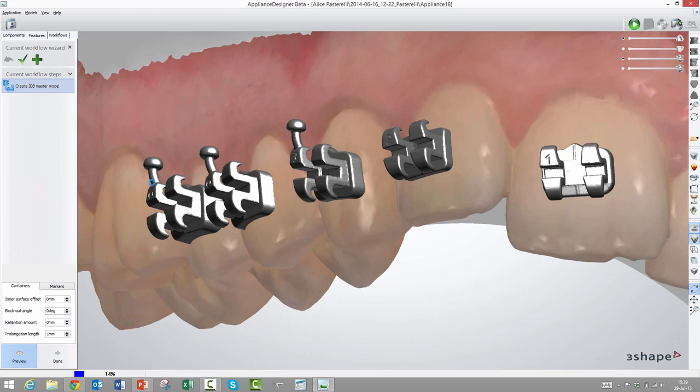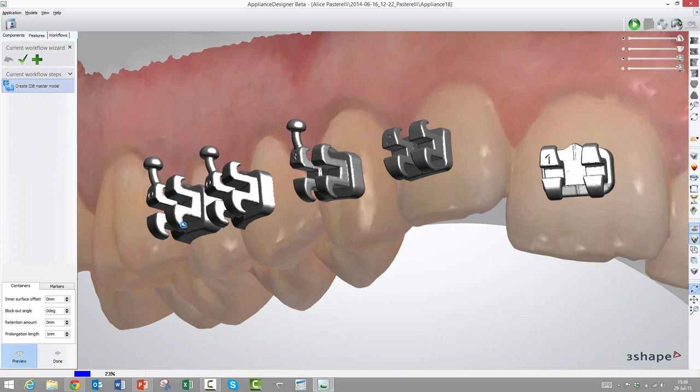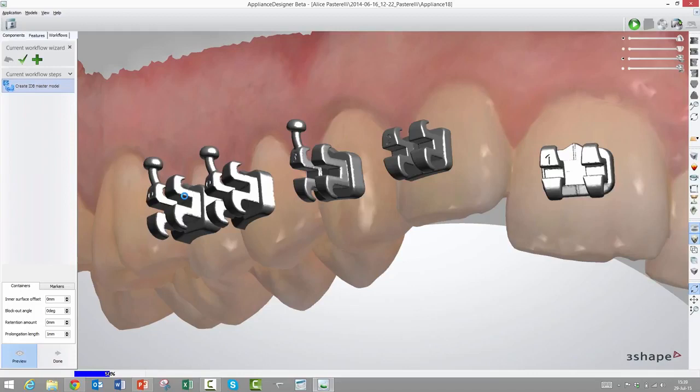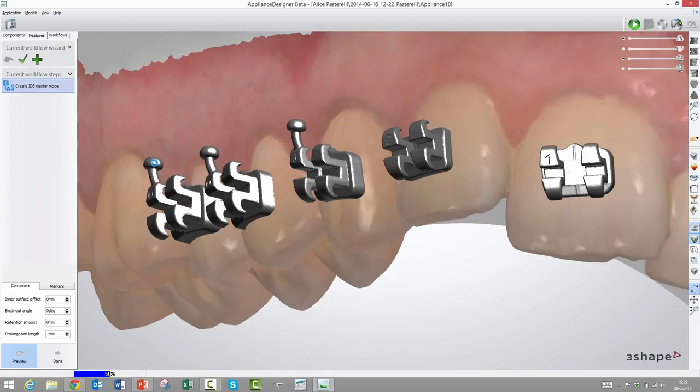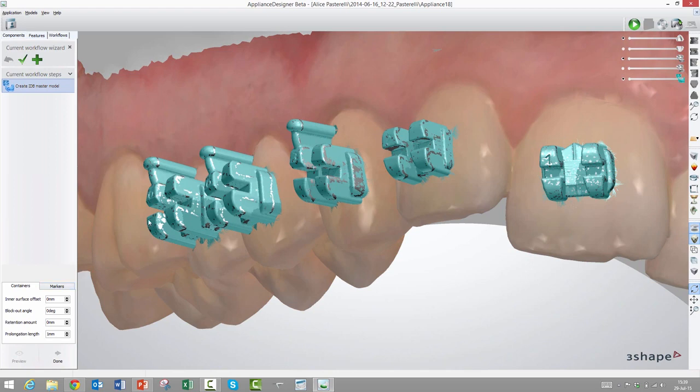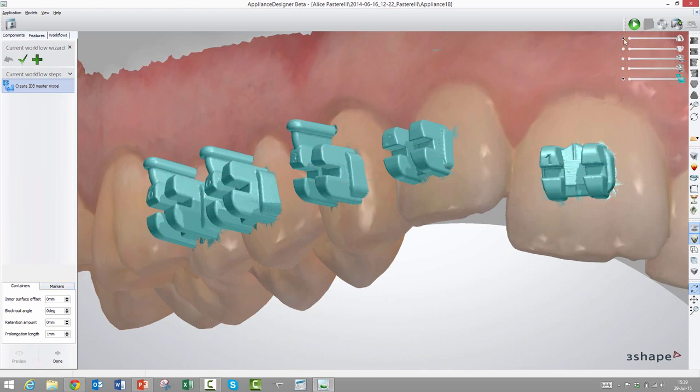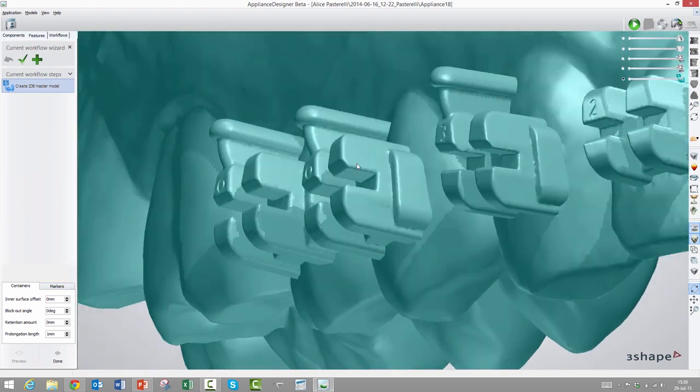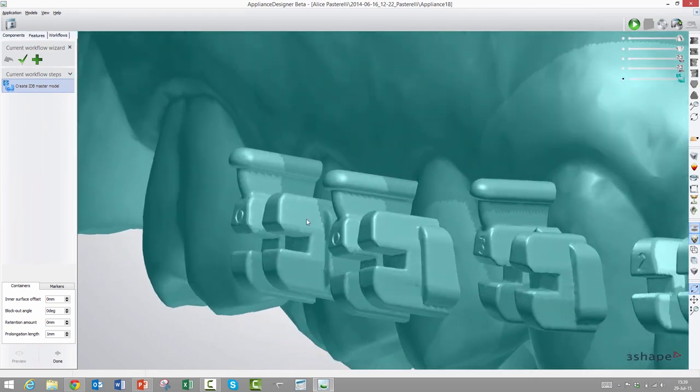We will have it start doing its processing while I explain what the various options and parameters are for. The first one is called inner surface offset, as in markers, and it's essentially the same thing. On purpose you can make these containers, as we call them, either too big or too small. A container is a bracket representation, but with one noticeable difference, and that is that all the undercuts are removed. By undercuts, I mean in relation to the insert direction of the bracket into the vacuum form transfer tray.